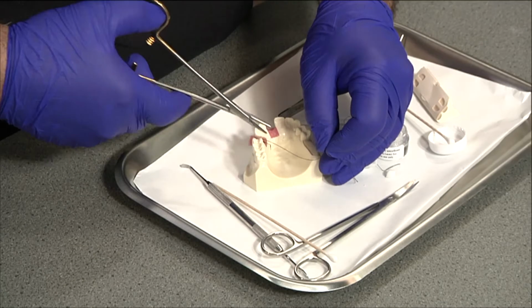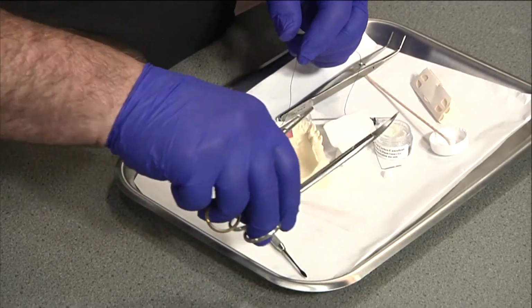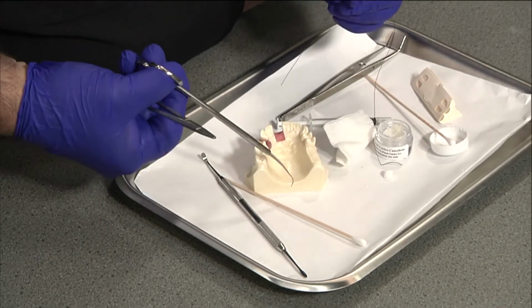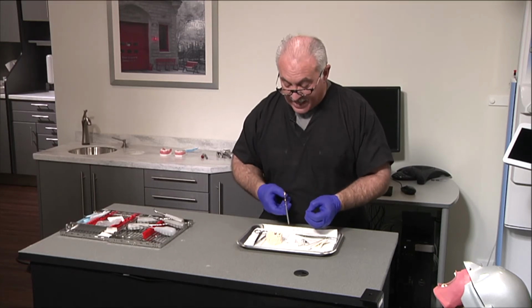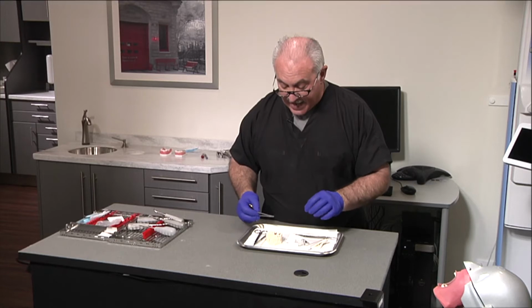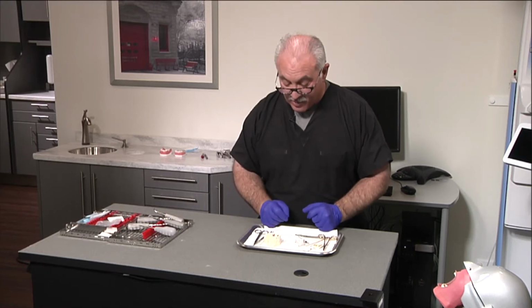We're usually in the aesthetic zone for this exercise, whether it's premolar or incisor. We are taught in dentistry to have the knots on the labial, but more often than not, the patient is going to be leaving with a transitional removable appliance, aka a flipper or an essix. And the last thing you want is the knot sticking out on the labial. So I either tie them on the palatal or rotate them after I tie and cut, so it's not showing through. I'm just throwing 1 interrupted in there to give you an idea, and I usually just do an X. On occasion, you may need a third one in the middle.